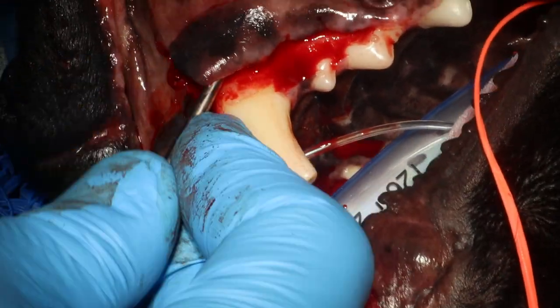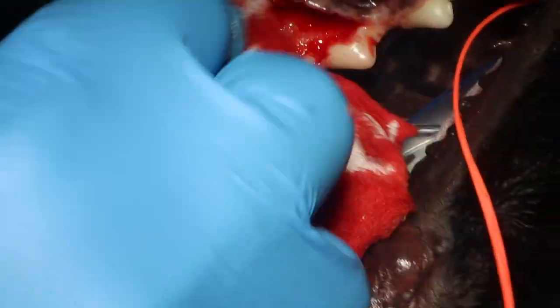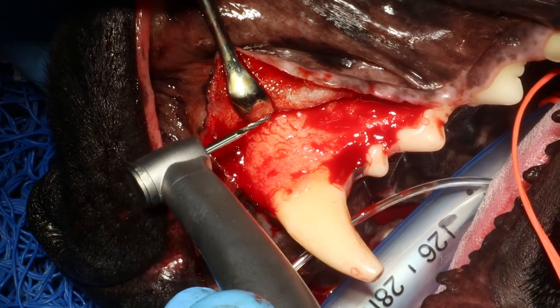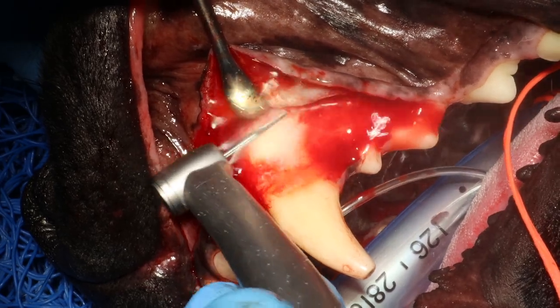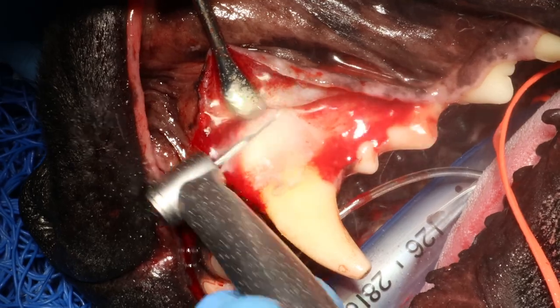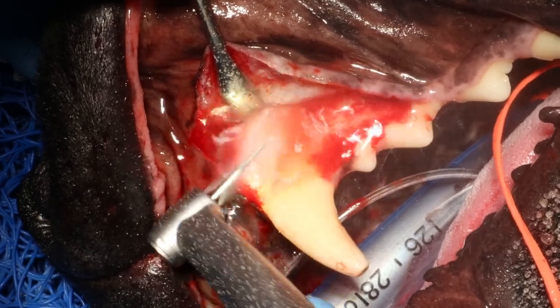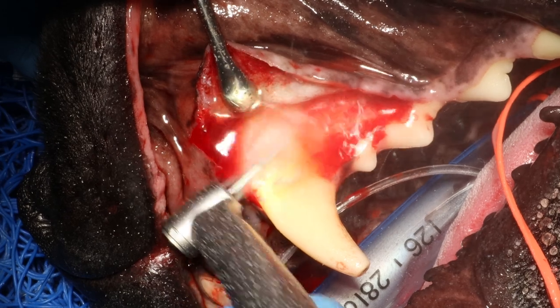The next part is drilling away the bone from the tooth root. For doing that I use a straight cross-cut tapered fissure burr called a 701L, or surgical length — it's a little bit longer than a normal burr. I use the side of this burr to drill away the bone, though you can use a round burr if you prefer.